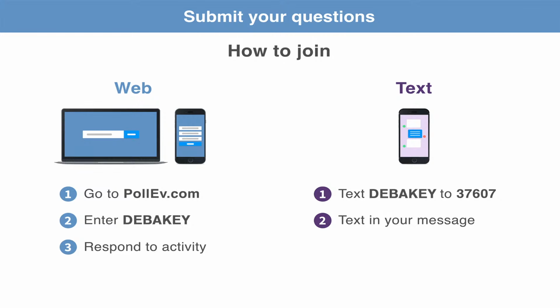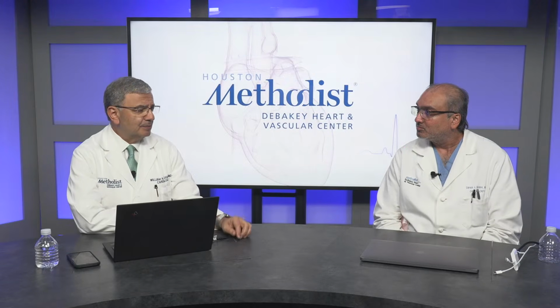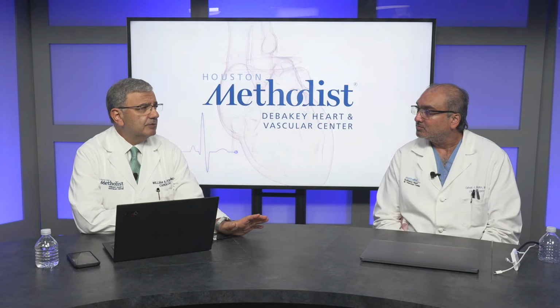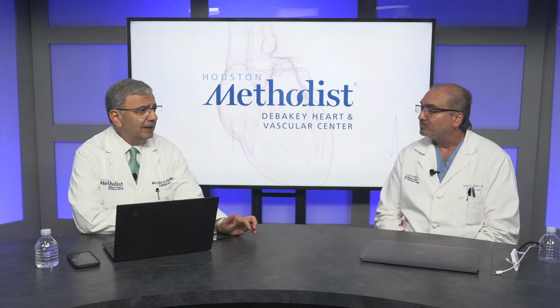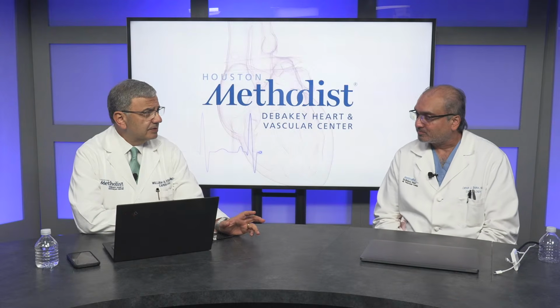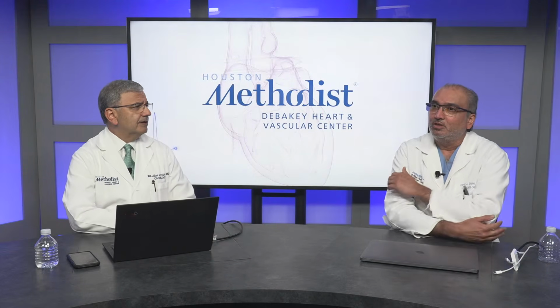A question for you, Dipan. Biological valve as opposed to mechanical. How much artifact do you have from the ring itself? Does it impair seeing the leaflets, and are there maybe any sequences that you would do to decrease that artifact?